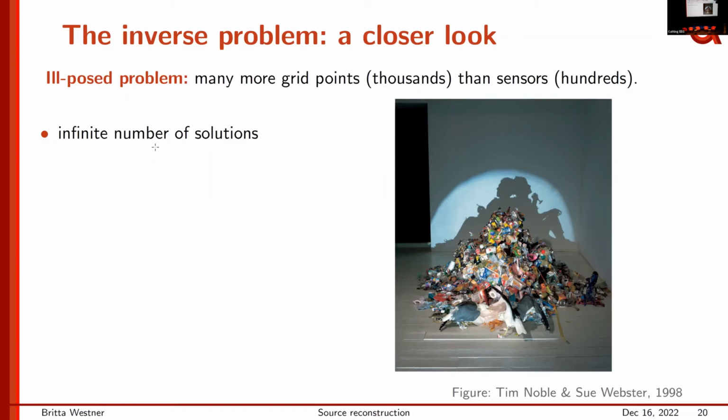And this is what you actually recorded on sensor level. And just like in this piece, we have an infinite number of solutions for how we can project our data back to where it originated from into source space, because we have those very, very many dimensions there.